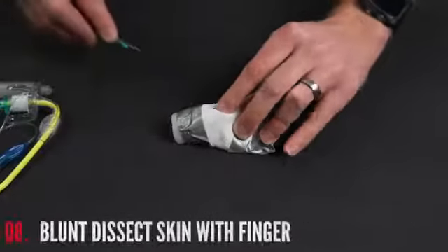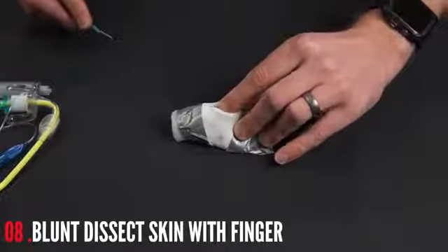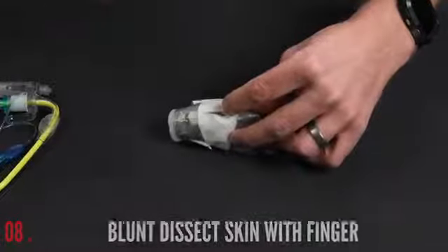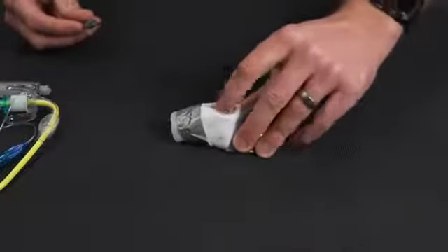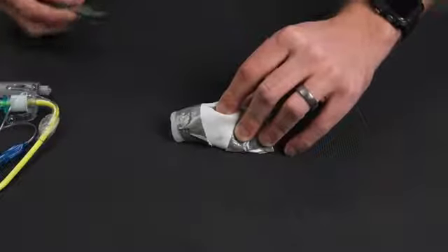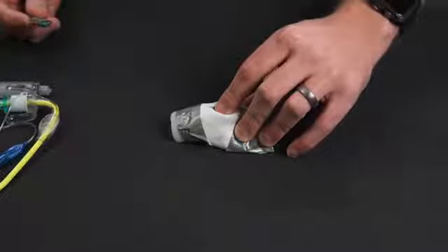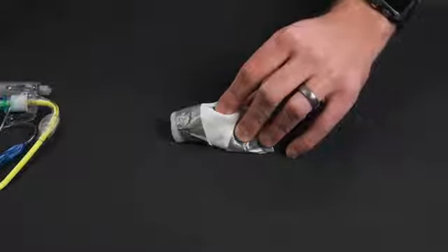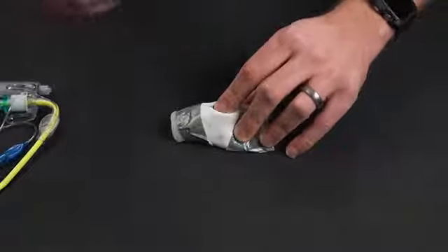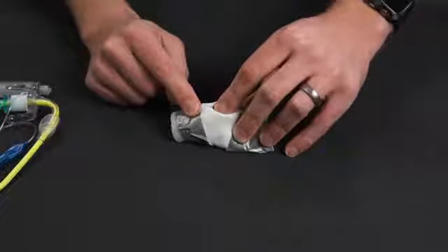I'm going to take my finger and I'm going to blunt dissect with that finger, making sure that I can actually feel the membrane underneath it. So if you actually see that there, you can see the quote membrane, aka the duct tape I have in place. So we've blunt dissected down with that finger, and that finger is going to hold that steady. From this point on, this procedure is actually a tactile procedure. You do not need lights or even visual cues to tell you where it is. That's really important because periodically these will become extremely bloody and you're going to have to kind of insert blind.